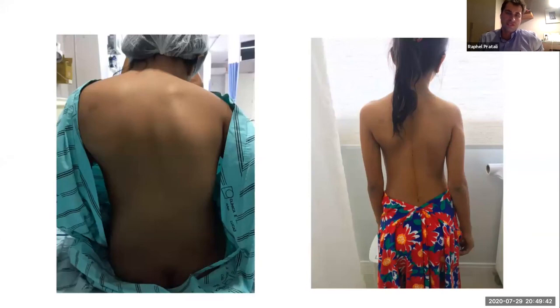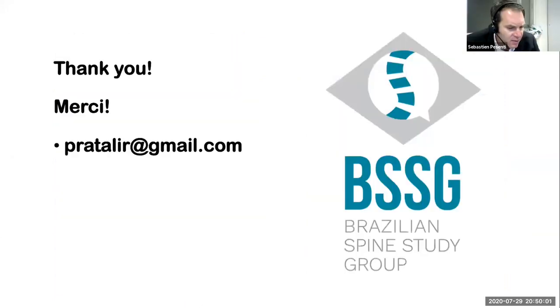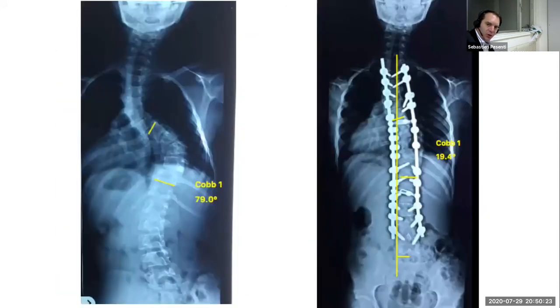Don't you use it in France? Yeah, we do. For a very long time, there was a neurophysiologist in the OR with us. And now for like 5 years or so, we have the NIM Eclipse from Medtronic. It's a surgeon-driven neuromonitoring, a simplified neuromonitoring, but yeah, we do. And especially in these cases of neurofibromatosis, first of all, you have the very angular deformity that is at risk, as you said, of neuro event, and you have the neurofibromatosis itself, where the spinal cord is very sensitive. So, that's a great case.